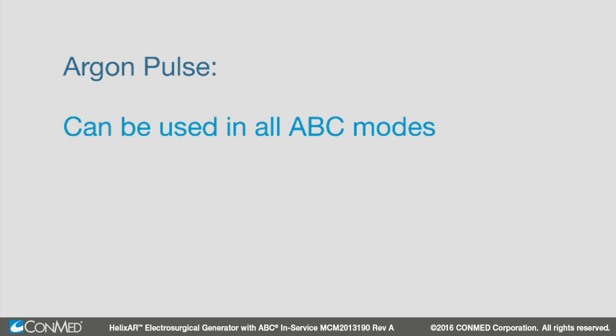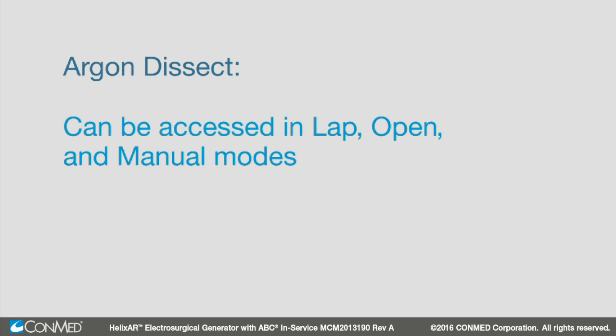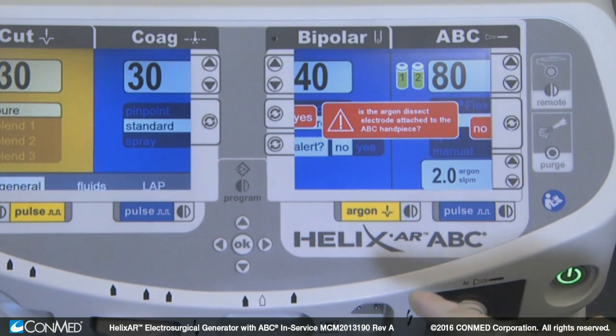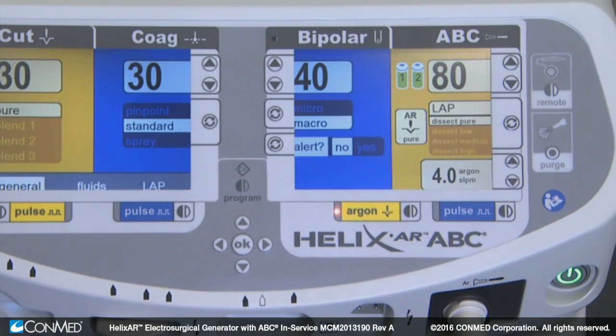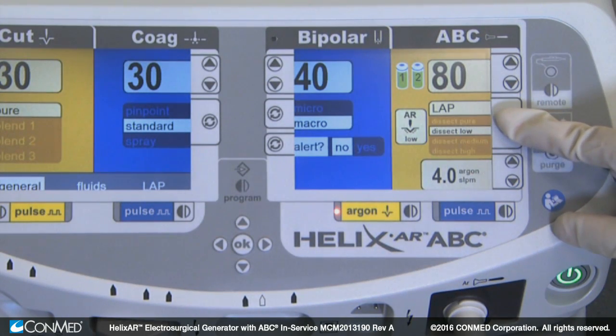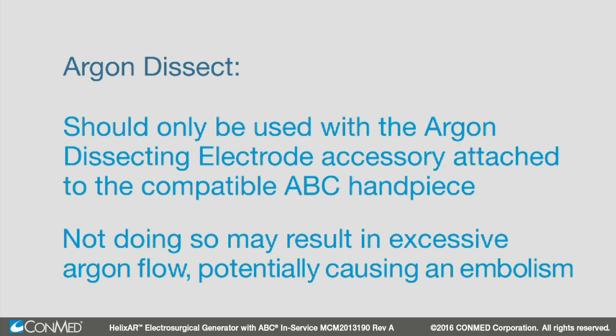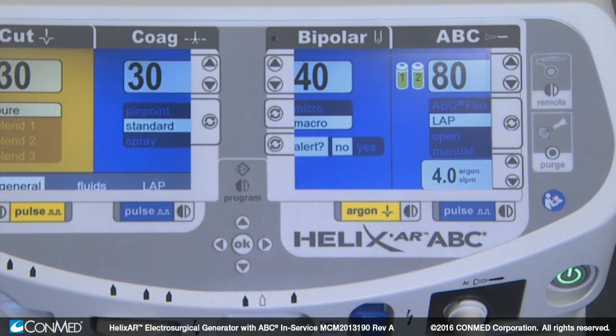These modes can also be used in conjunction with argon dissect and argon pulse modes. Argon pulse can be used in all ABC modes. Argon dissect can only be used when in lap, open, and manual modes. When the argon dissect key is selected, the system will prompt the user to verify the use of an argon dissecting electrode. Once verified, argon dissect mode becomes activated and four options are available: pure, low, medium, and high. Argon dissect should only be used with the argon dissecting electrode accessory attached to the compatible ABC handpiece. Not doing so may result in excessive argon flow, potentially causing an embolism.